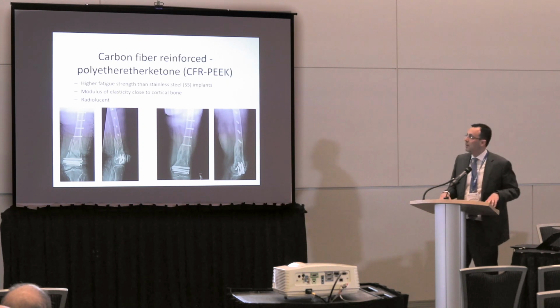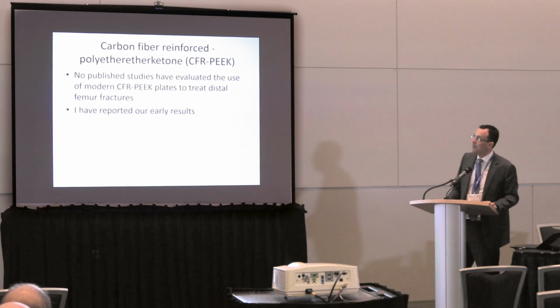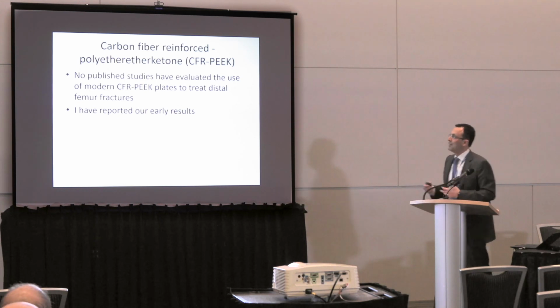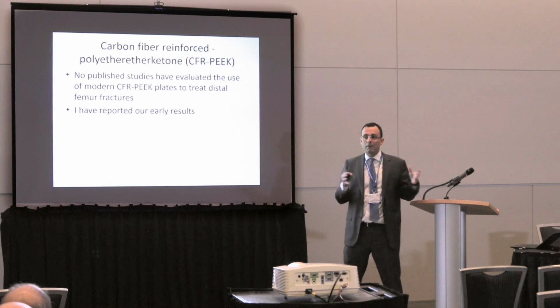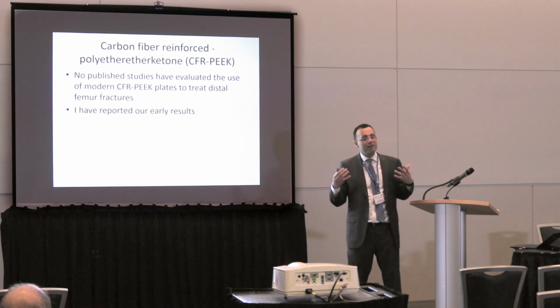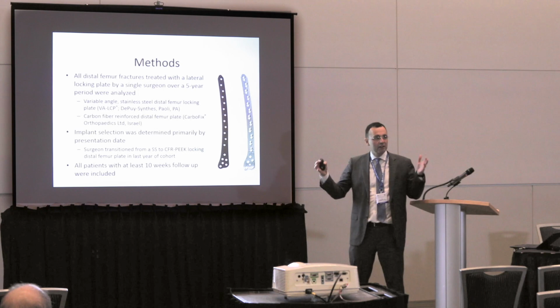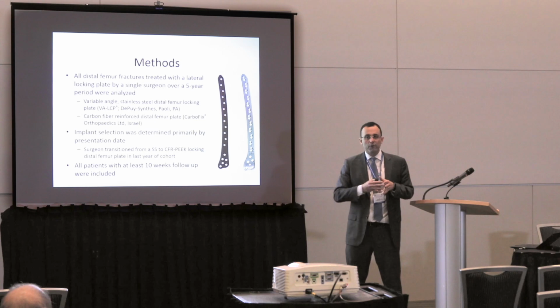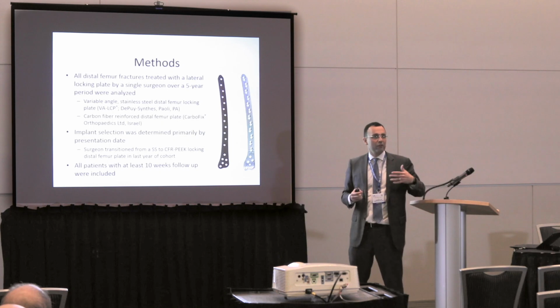My distal femurs that I get, I wanted to use CarboFix plates and see how they did. I realized there was really no plate out there, or no studies that talked about the CarboFix plates versus stainless steel. So I decided to describe my experience with these. For over a year, I essentially used all CarboFix plates for distal femurs, and I compared my series of CarboFix plates to my series of stainless steel plates from the prior 3 to 4 years.